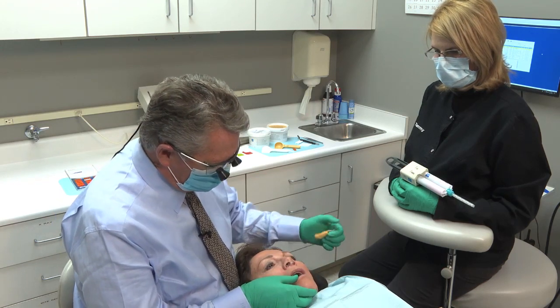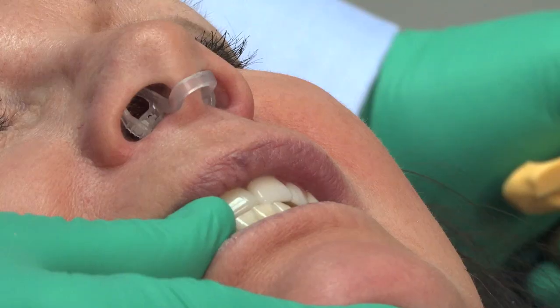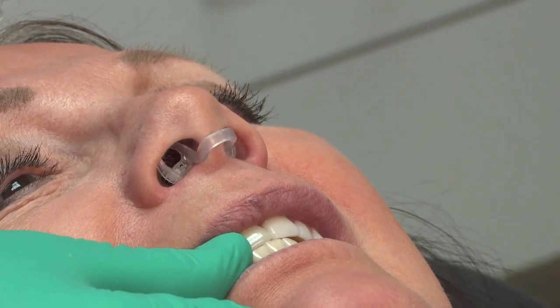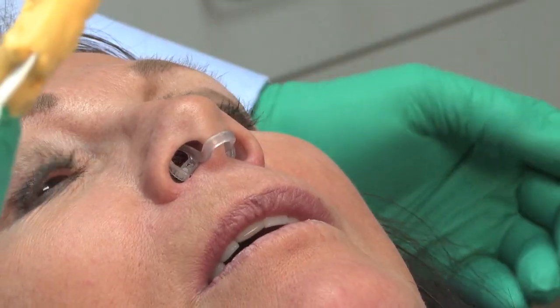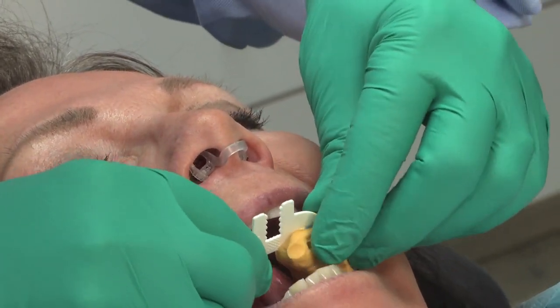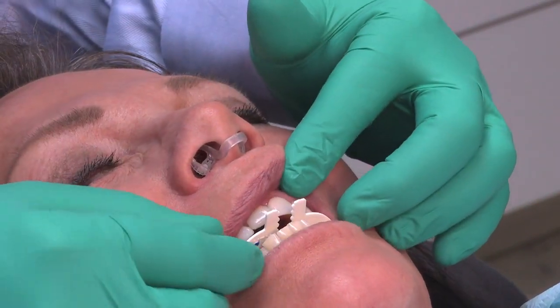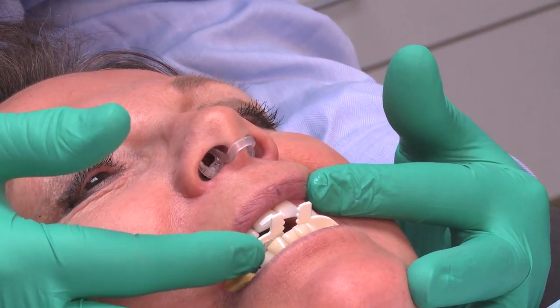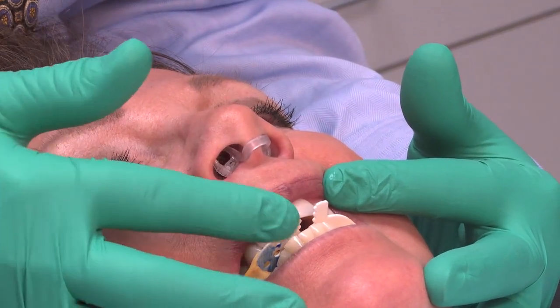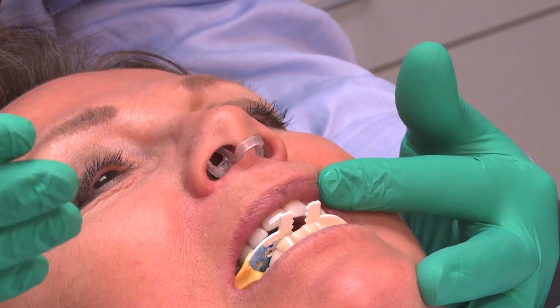So Kim, go ahead and move your teeth forward edge to edge, bite together edge to edge. And you'll see that Kim has approximately a 3 millimeter shift to her right. And when we put our bite registration back in, we want to verify that. So I'm going to reseat this and verify that our midlines are properly aligned. Close together. And the beauty of the Airway Metrics system is this. Since this area is totally open, I can verify with my bite that her shift is 3 millimeters to her right. So we know that we have her in the correct position.